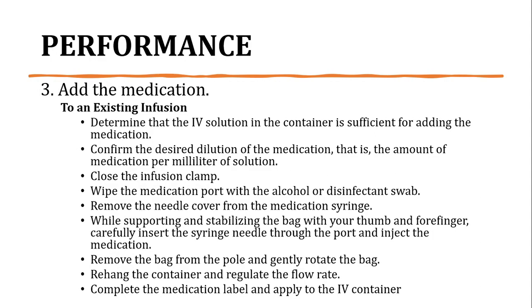I-adjust po siya kasi bawas na yung container. So, for example, for 500 ml IV bag, if ever, kapag ang natira na lang dun, example is 300 ml, kailangan i-calculate yung medication na kailangan i-administer based on the proper dilution of the medication.